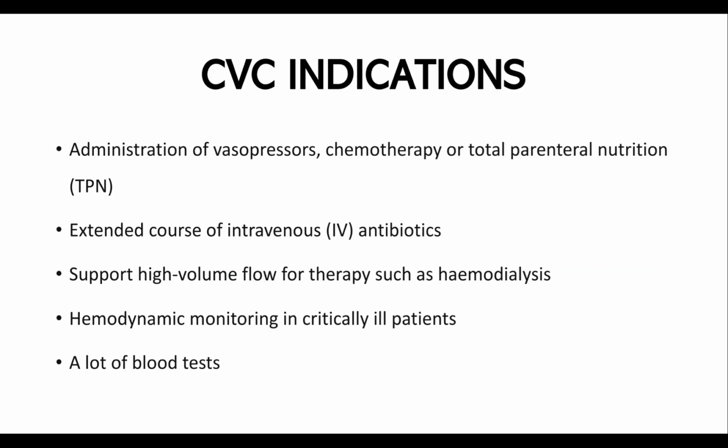CVC indications: administration of vasopressors, chemotherapy, or total parenteral nutrition (TPN), extended course of intravenous (IV) antibiotics, support of high volume flow for therapies such as hemodialysis, hemodynamic monitoring in critically ill patients, a lot of blood tests.